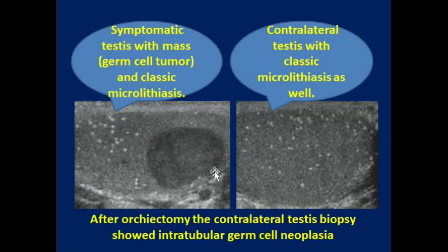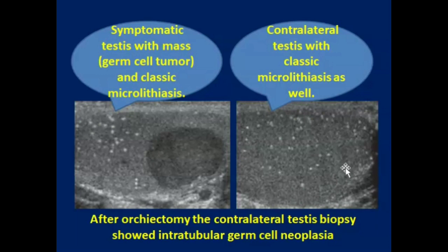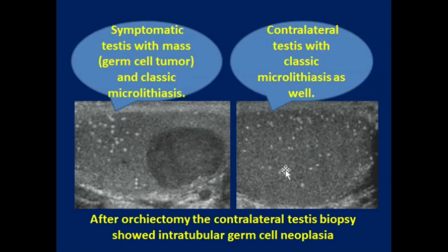This image shows a hypoechoic mass of the testicle, which was revealed to be a germ cell tumor. This tumor is accompanied by classic microlithiasis. The contralateral testis with classic microlithiasis is also present. After orchiectomy, the contralateral testicle biopsy showed intratubular germ cell tumor.